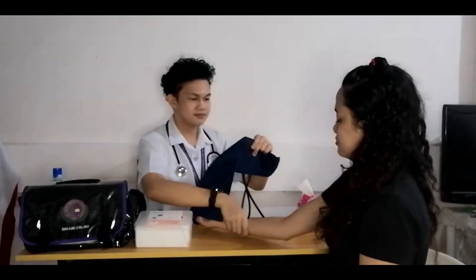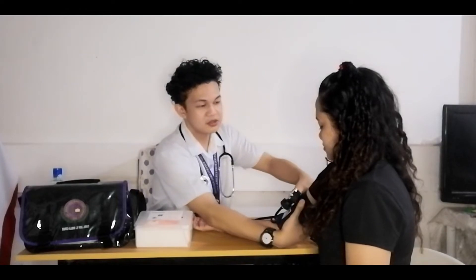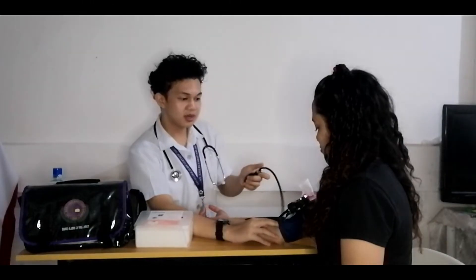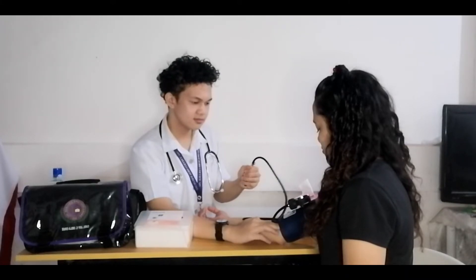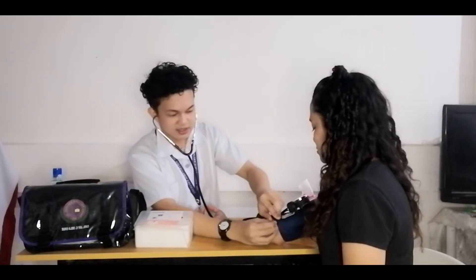May I have your hand please? If I may ask, Ms. Cindy, did you take caffeine or drink coffee earlier? No. Alright, I'll just wipe this off. Just relax your body. I'll just insert this — so let's go under these. Just relax your body.